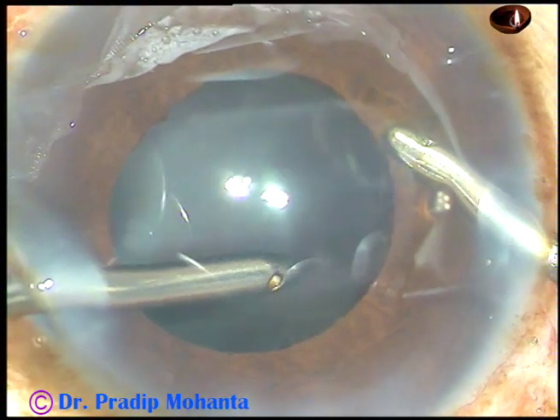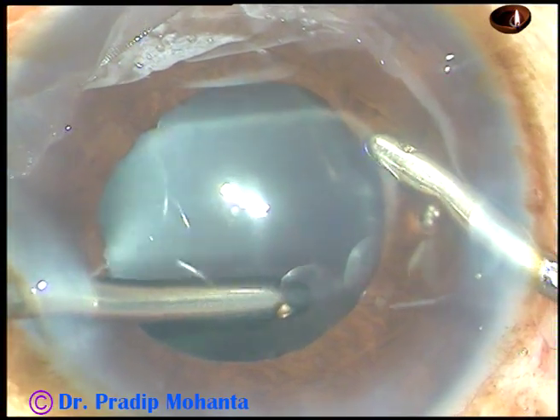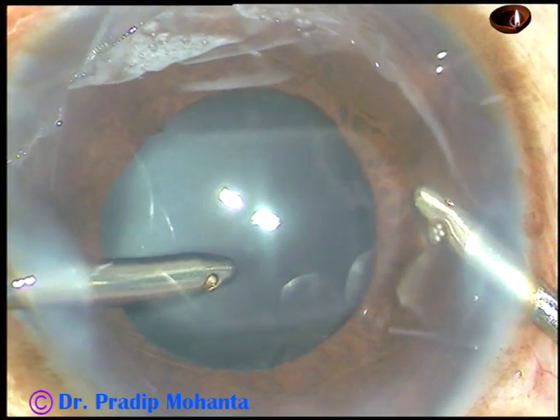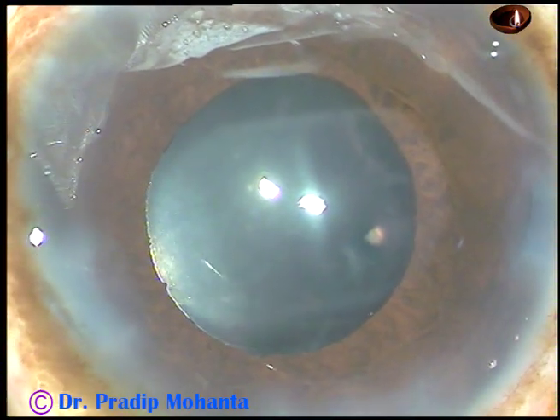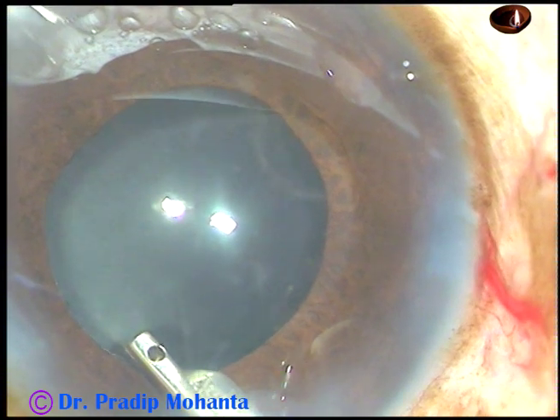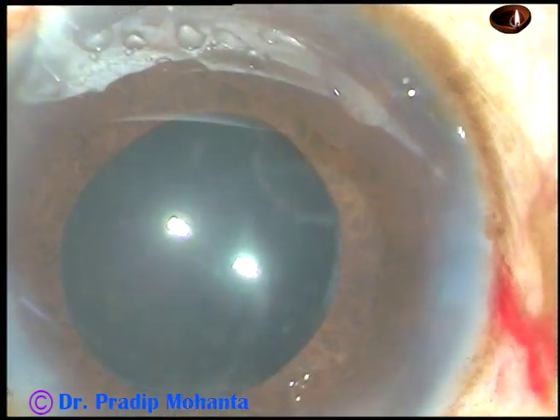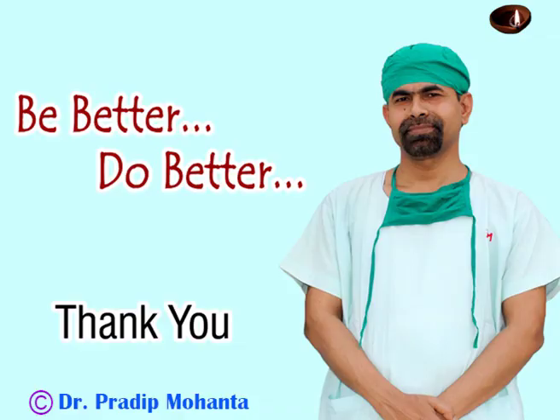All the viscoelastic is removed very nicely — thorough cleaning of viscoelastic is done. Then, after hydrating the corneal stroma on either side of the side port, the wound apposition is formed very nicely and the case is concluded. Thank you very much for your attention. Hope this video will help you in developing your surgical skills. Be a great surgeon and serve your patients with love, respect, empathy, and great surgical competence.